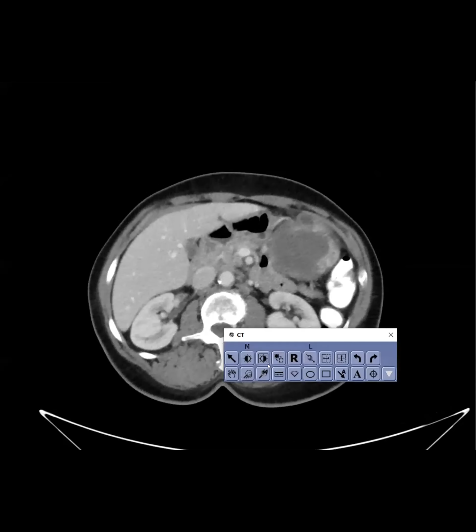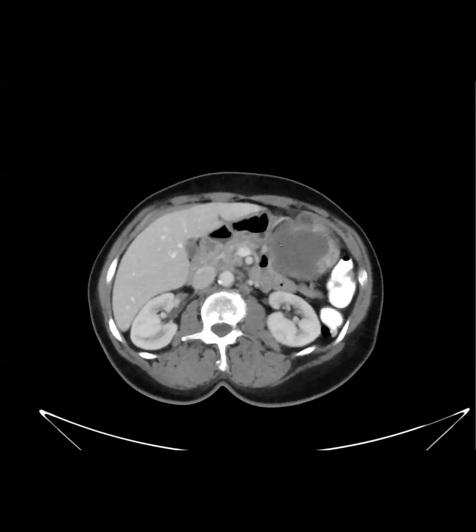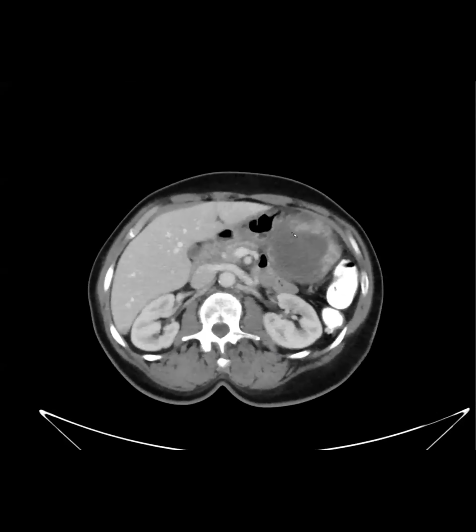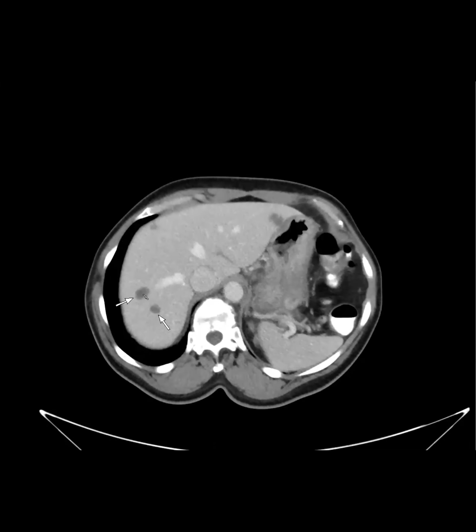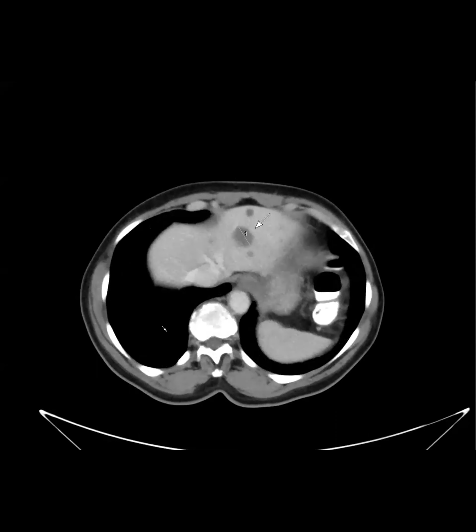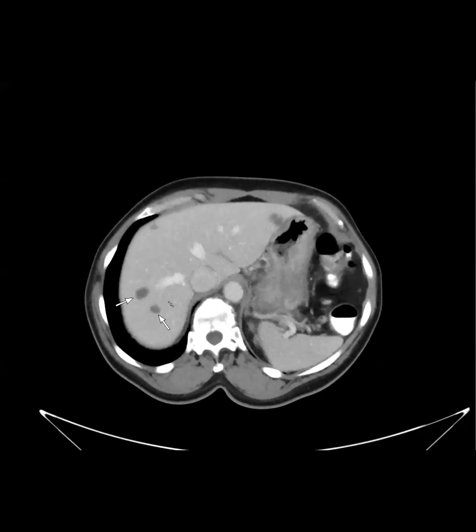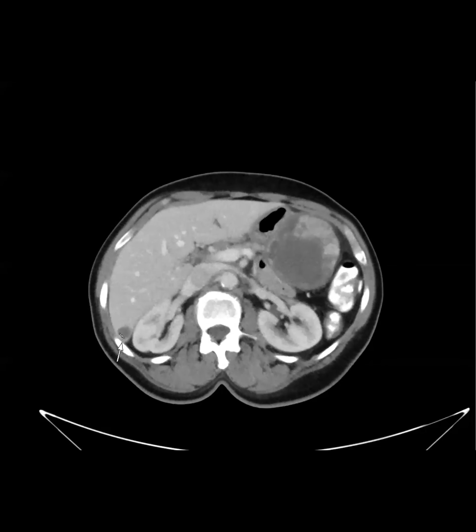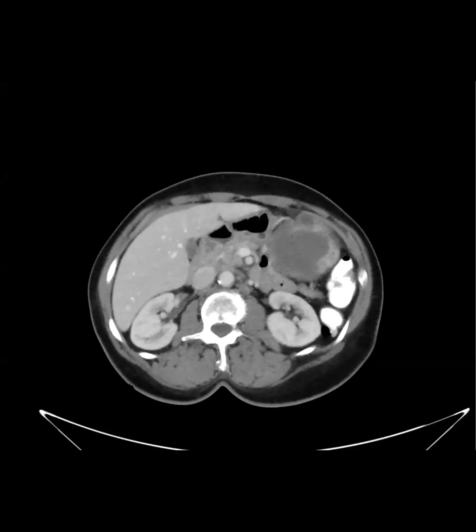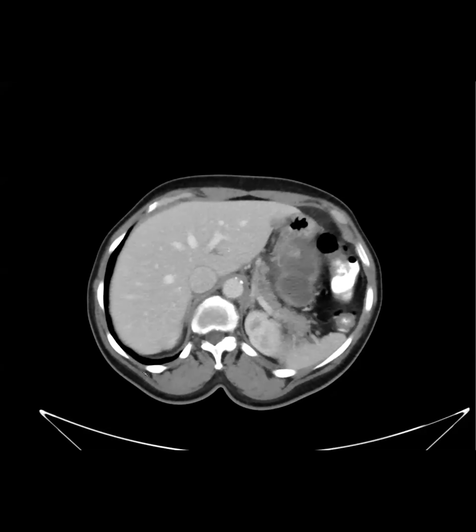So you can see that the primary GIST tumor has decreased in size, so it's responded to the Gleevec. And the liver lesions have also decreased in size and become cystic. So whenever you see cystic looking lesions, but the patient has a pretty aggressive GIST, always go back in time and see if maybe those were actually METs, because when they get treated, they liquefy and they look very much like cysts. The patient continued on their Gleevec.